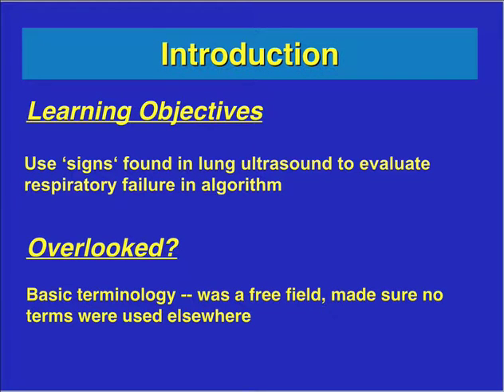Our learning objective is to use all the signs that we've talked about so far in lung ultrasound and evaluate respiratory failure in an algorithm. There are a couple of them out there, but the most common one is called the BLUE protocol, and we're going to talk about that.